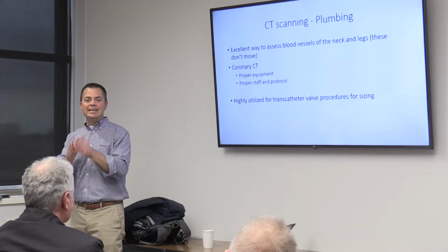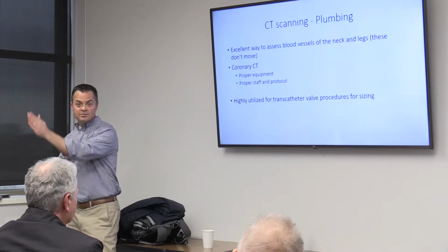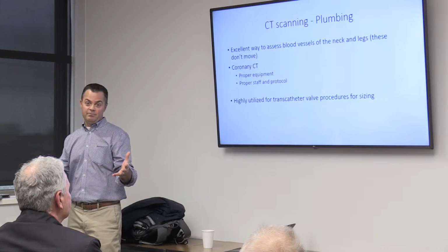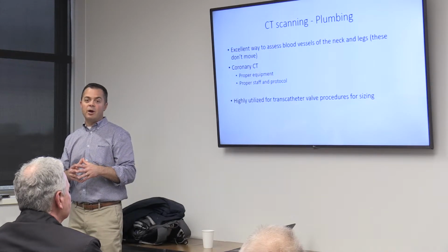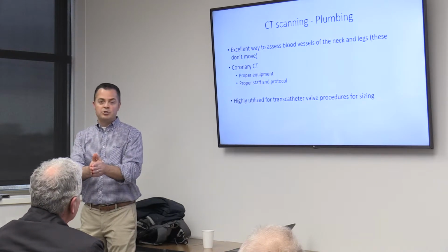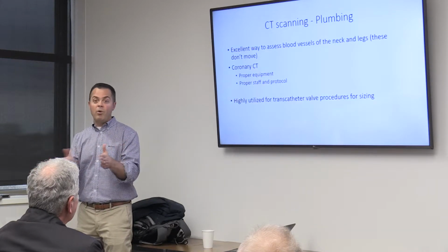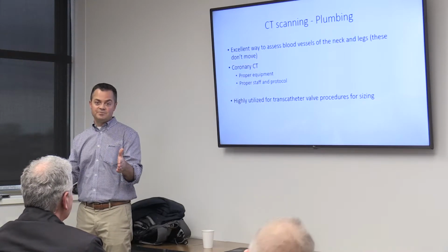So they'll actually gate the CT scan with your heartbeats, okay? And then they know when to acquire in between the heartbeats. That's how amazing this is. Now imagine if we had a patient who had premature beats every third beat, boom, boom, and then a premature, again, it's not a good patient for this. We don't want the heart to beat right in the middle of the acquisition.